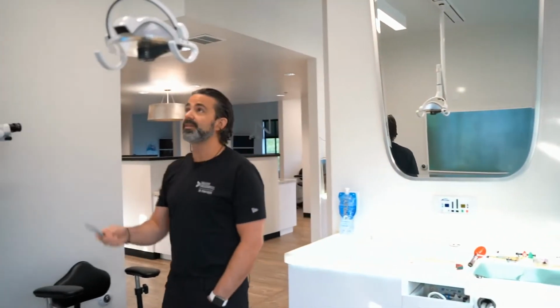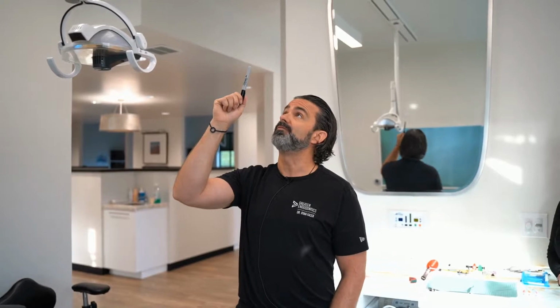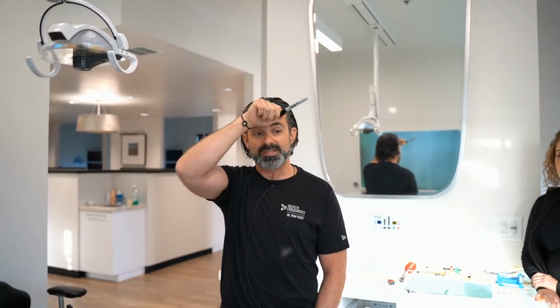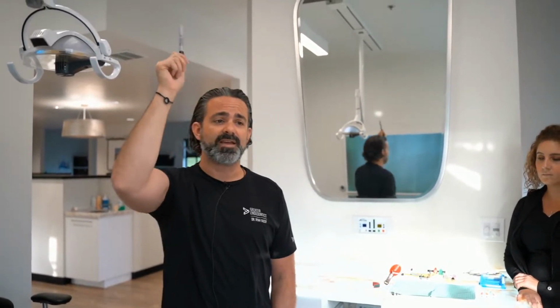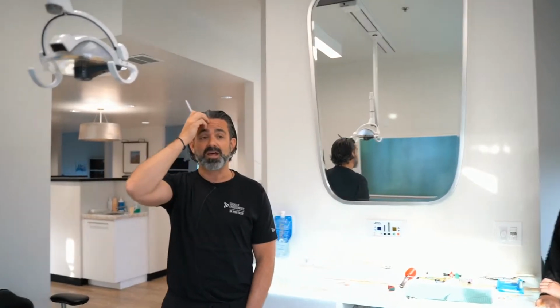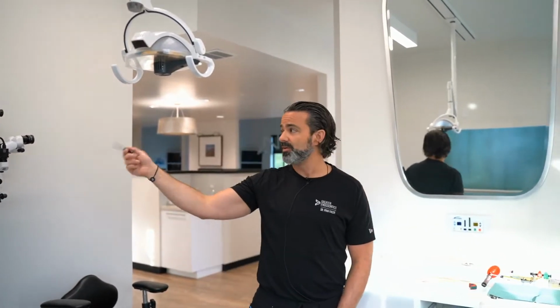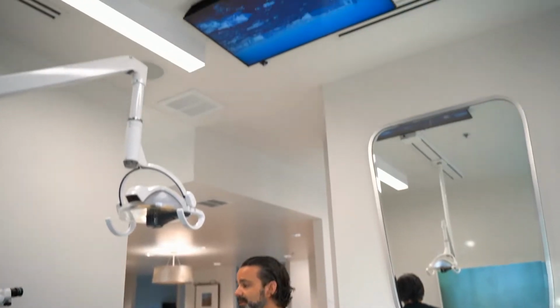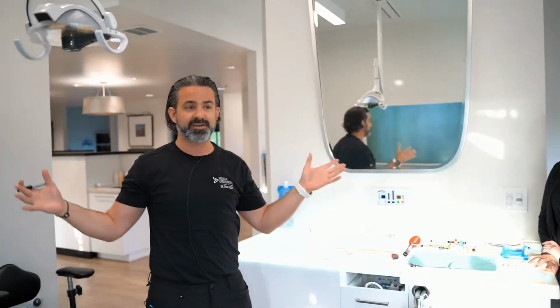The other thing is if you go from the ceiling, you really need to reinforce the ceiling for the same thing, if your building has compressors and things. Right now I'm on the 2nd floor of the building, and sometimes that's an advantage. However, I've had a lot of luck from the ceiling. In this office, I went to this 3 o'clock wall right here, partly because in this operatory room I wanted it to be very open, and it's very clean and light. I've also done behind the patient's head, the 12 o'clock position, and that also creates a very open feel.